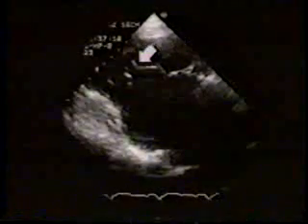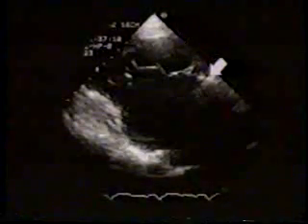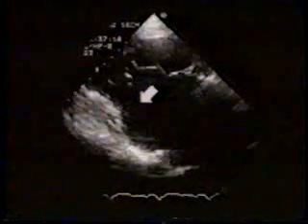This is the right ventricular inflow view. Note elongated anterior tricuspid leaflet, which originates normally at the tricuspid annulus in this position. Here is the markedly displaced septal leaflet. This is a large atrialized portion of right ventricle. Observe these in real time now.